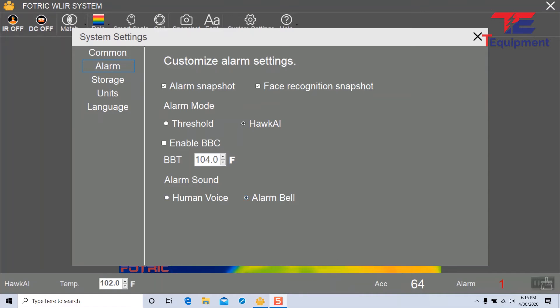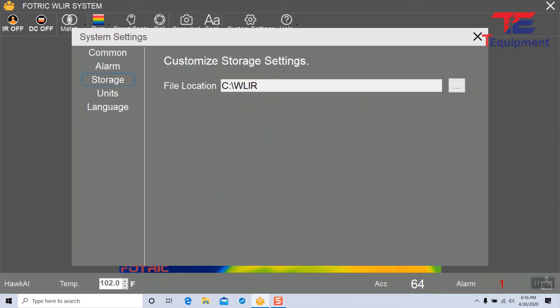Now we can continue to storage. Storage is the path where you want to save those snapshots that you're taking, perhaps those alarms or the people that are passing by if you need to capture that data.